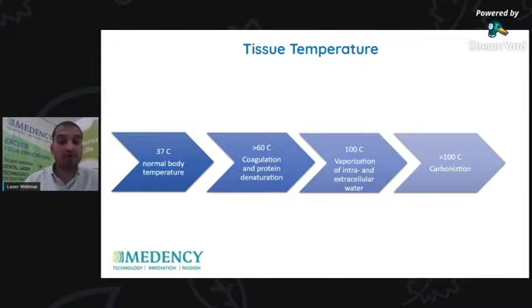We can coagulate the nerve endings, which will prevent pain, and we can coagulate the lymph vessels, which will eliminate the edema. That's why we say that laser works without bleeding, without pain, without edema, or any side effects. But what happens if we keep raising the temperature, if we keep using the laser and the temperature is raised?